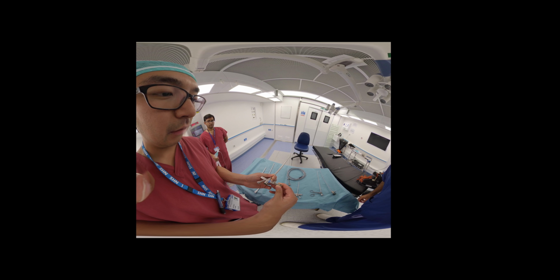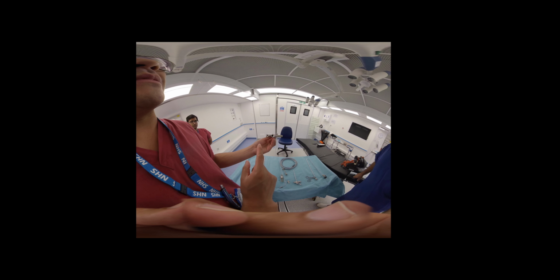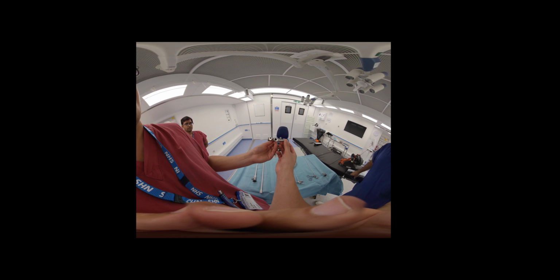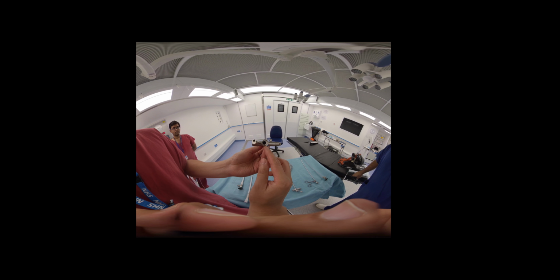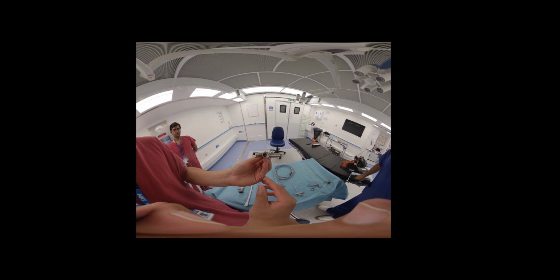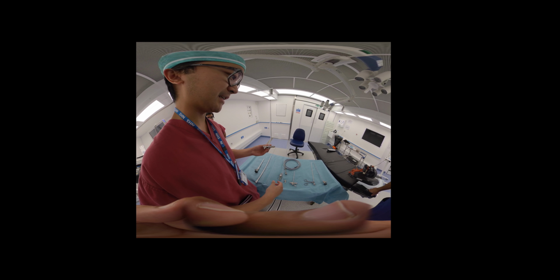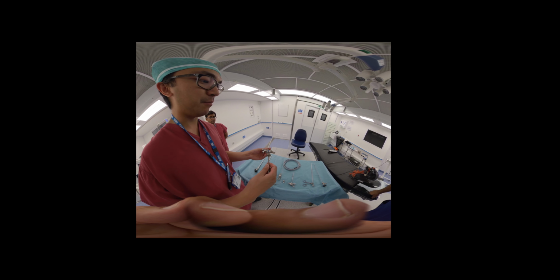Okay. And why do you need it halfway in sometimes? So halfway in, if you're going to use the optical grasping forceps down the bronchoscope, if you have it fully in, where it's shining a light down via the prism, you will actually block the full caliber of the bronchoscope, so you need to pull it out before you actually introduce any instruments. And then the next thing is the bridge.